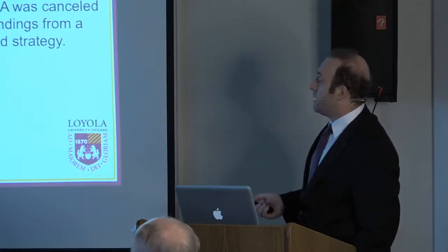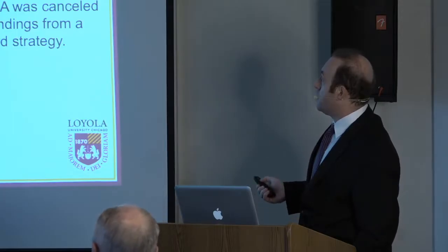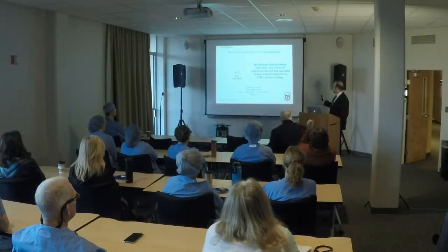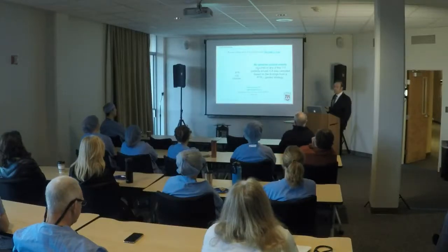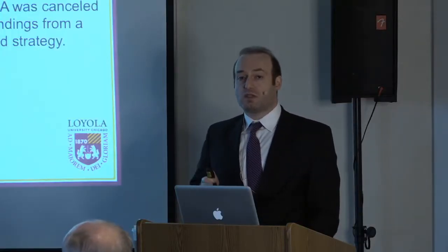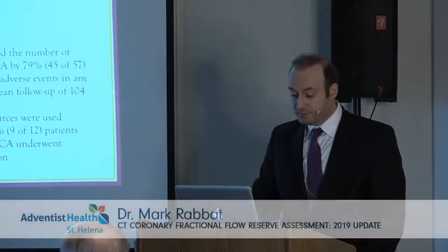Of the 61% of patients whose caths were canceled, there were no adverse clinical events in any of those 117 patients using FFRCT. And you can imagine that when you're safely deferring invasive coronary angiography, that's translating into a reduction in healthcare costs. And that's what they were able to demonstrate as well. There was a cost savings of 26% to the healthcare system. And this was even after accounting for the cost of the FFRCT analysis.